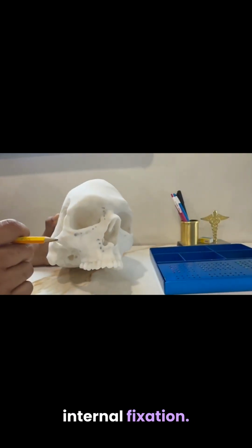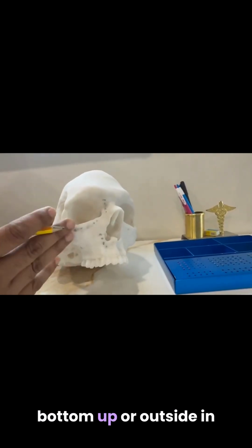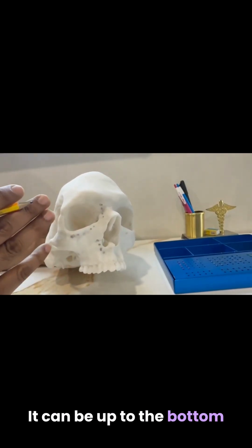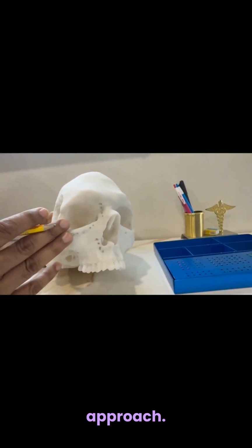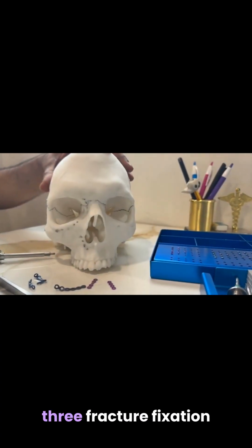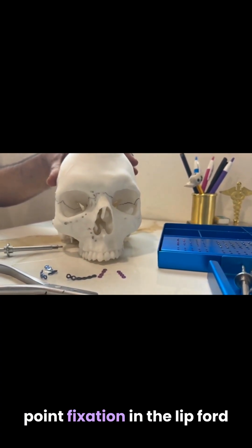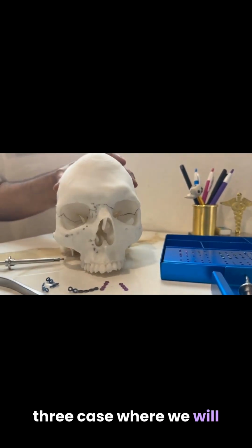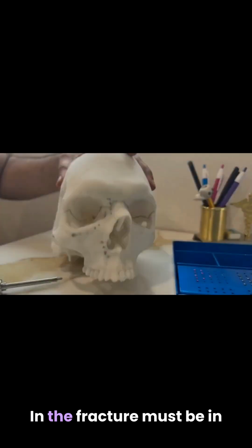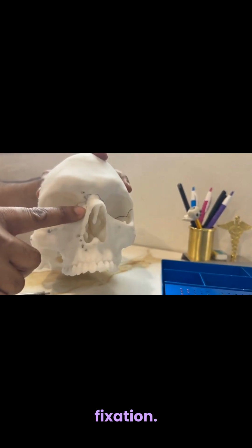Open reduction and internal fixation. The sequence of reconstruction is a bottom up and inside out approach. It can also be a top down and inside to outside approach. Coming to the Lefort 3 fracture fixation points, we go for a 3-point fixation, where we stabilize the occlusion by intermaxillary fixation first. The fracture must be in correct alignment before plating them to a rigid fixation.